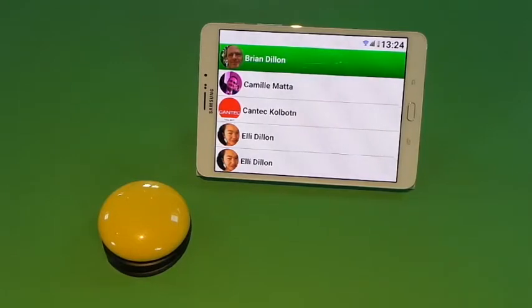So you can see that it is a consistent user interface for the user. They're not having to exit the ClickToPhone app and manipulate the default dialer or message app. The primary functions of a phone that most users require, such as making calls and sending texts, are integrated into a single consistent user interface.